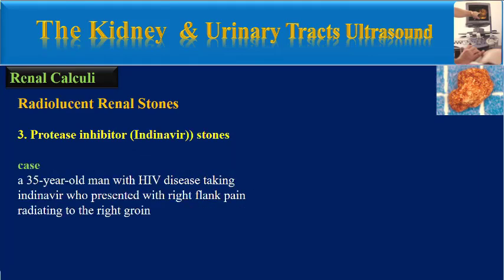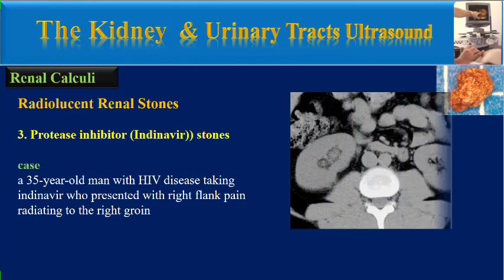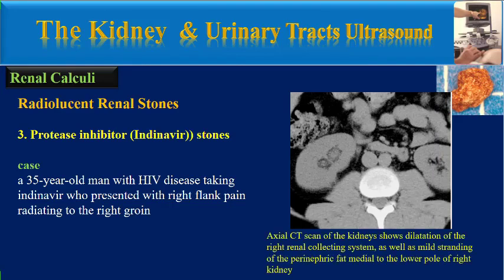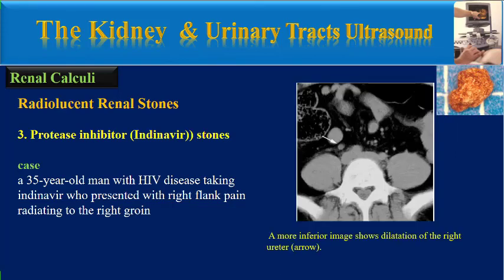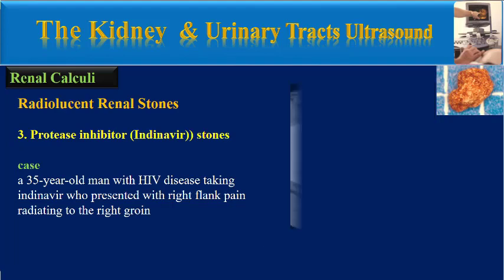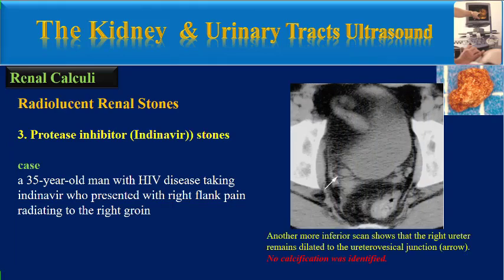This is one example. A 35-year-old man with HIV disease taking indinavir presented with right flank pain radiating to the right groin. A non-enhanced CT shows dilatation of the renal collecting system as well as mild stranding of the perinephric fat medial to the lower pole of the right kidney. A more inferior image shows dilatation of the right ureter.